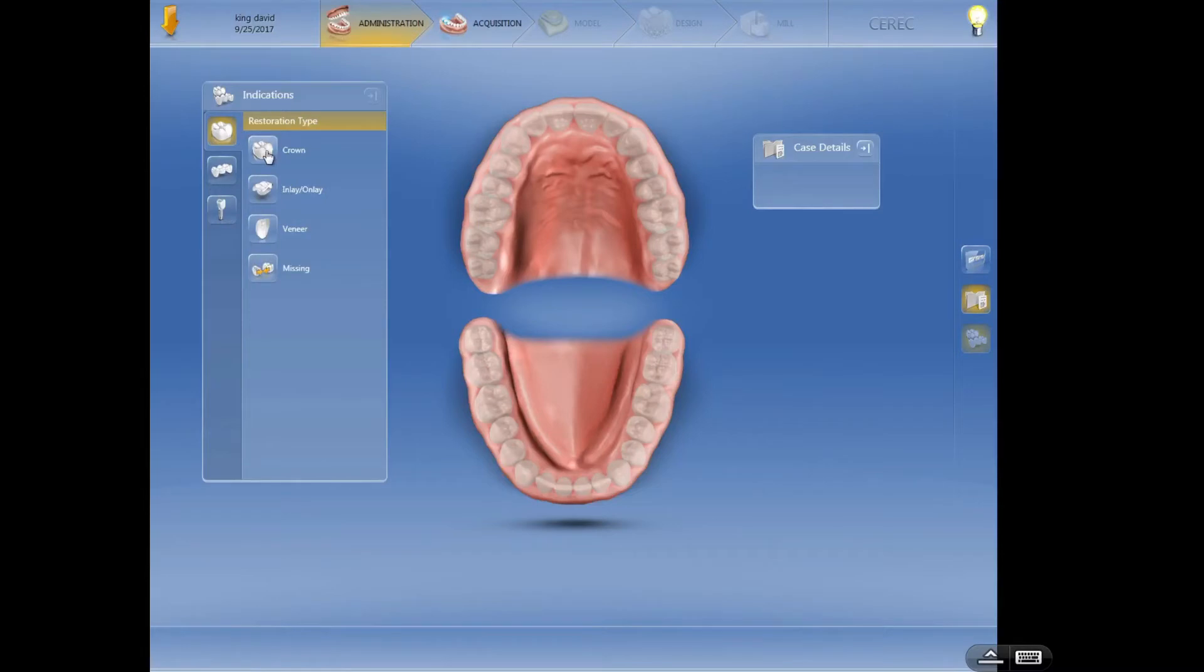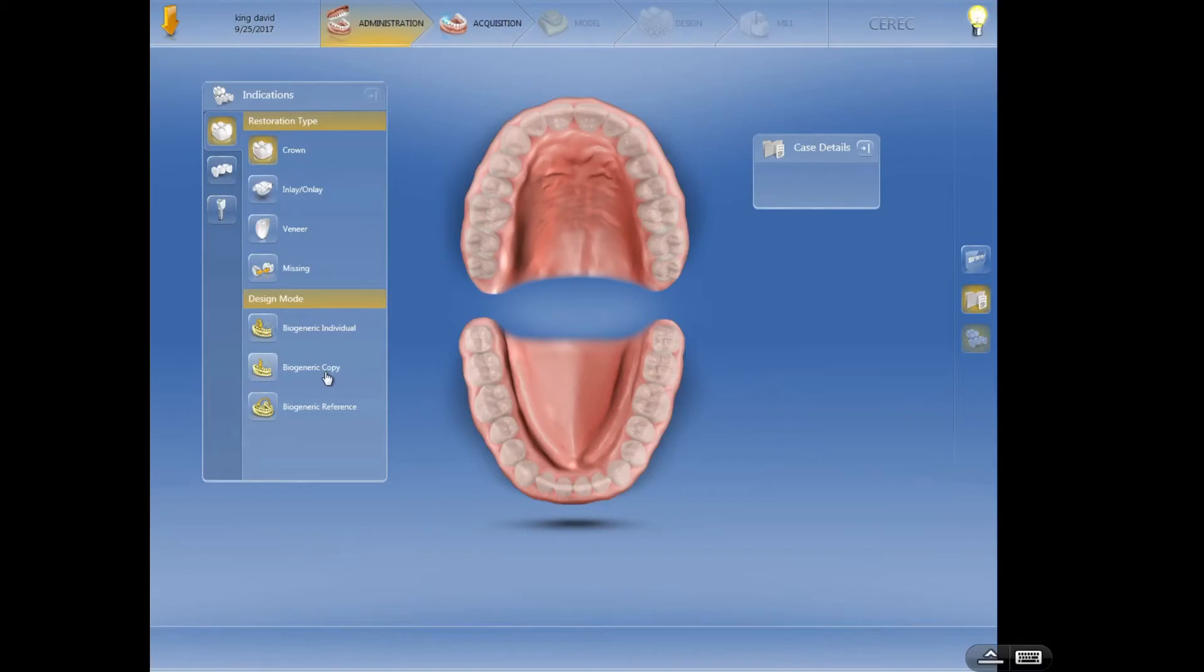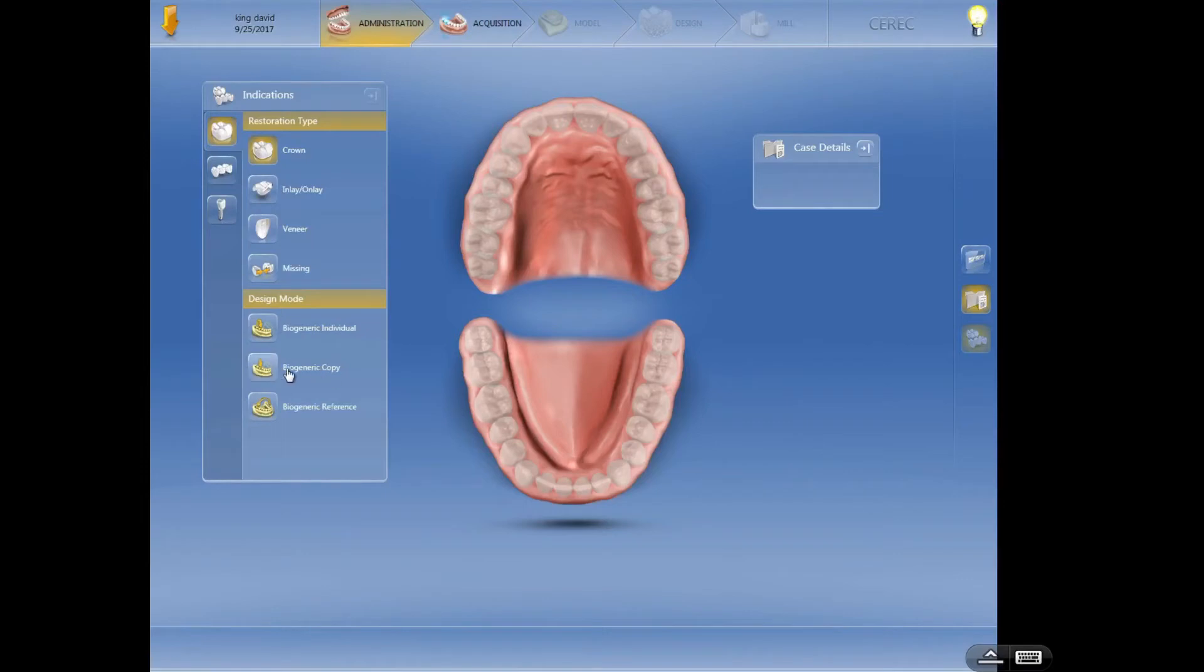So we're going to start with the crown. Very simple. Click on the crown. Then what's our design mode? I generally like to use biogeneric copy about 90% of the time if I can. Now this is all assuming that the restoration, or I'm sorry, the tooth surface is intact. Now if you've got a big broken tooth or a giant filling that's really flat, a lot of times I'll use the biogeneric individual option, but biocopy basically gives you a replication of what the tooth was beforehand.